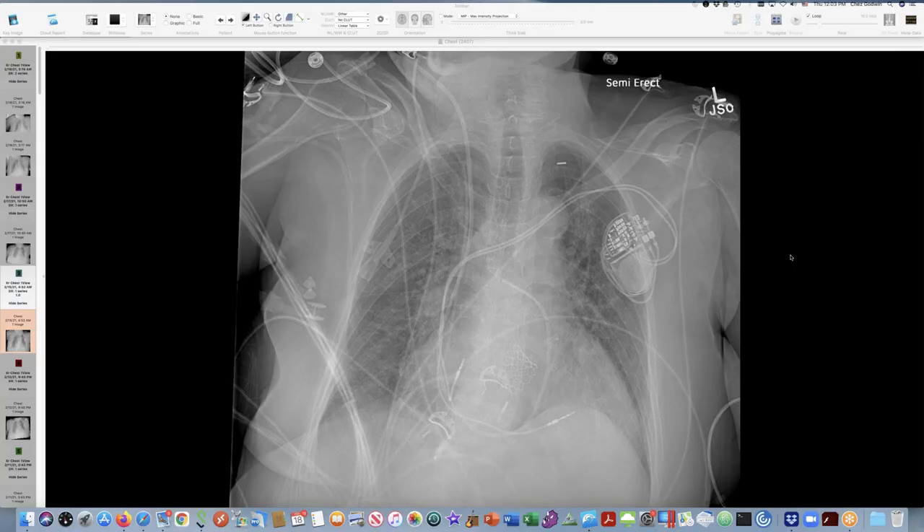Here is a heart failure patient who's had a TAVR, has a pacemaker, mild lung edema, and then has this funny clip up here and a funny little lucency tracking along here. Heart failure.